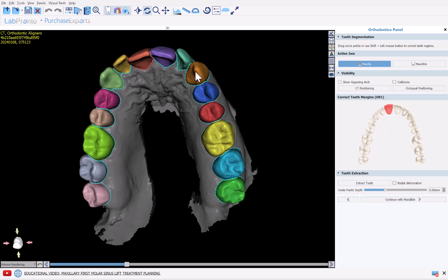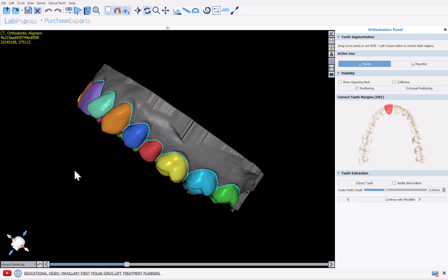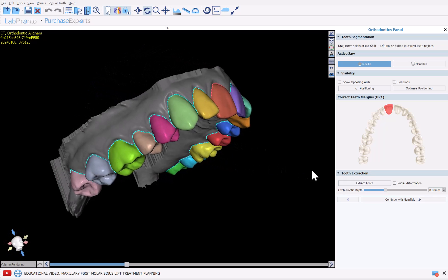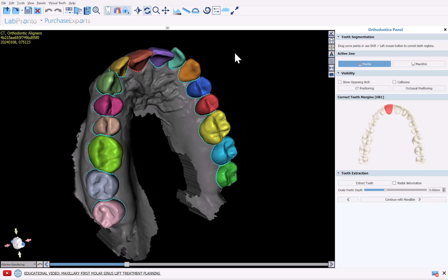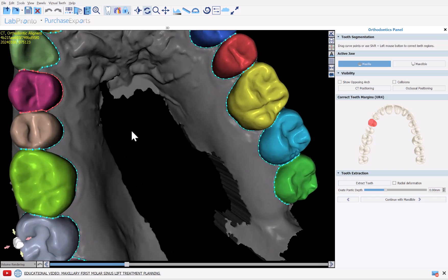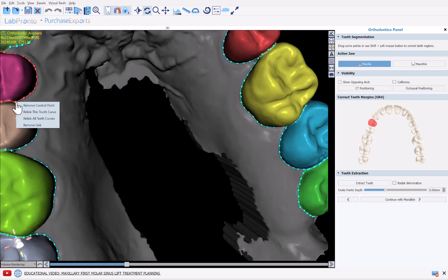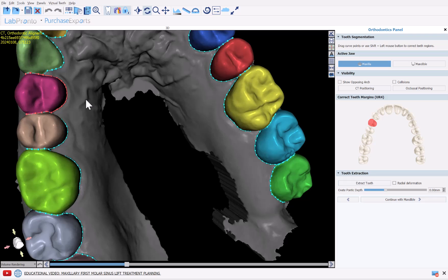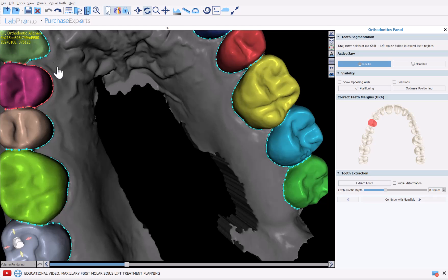The software has now automatically segmented the teeth. We could review the segmentation. If we need to make any modifications to the segmentation, simply left click on the relevant tooth. You could grab and drag any of the nodes. You could right click on a node and you have different options to link and unlink nodes that are between teeth. You can also simply redraw the curve by holding down the shift key and using your left mouse button and grabbing and dragging.